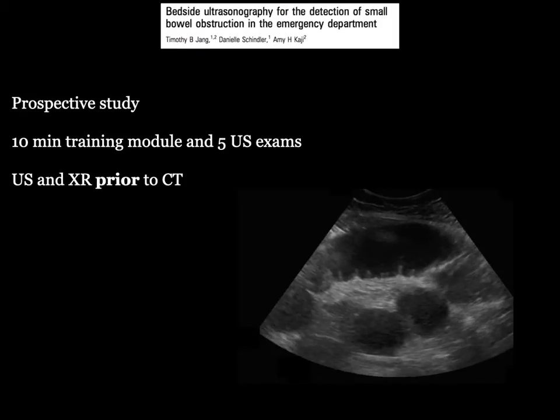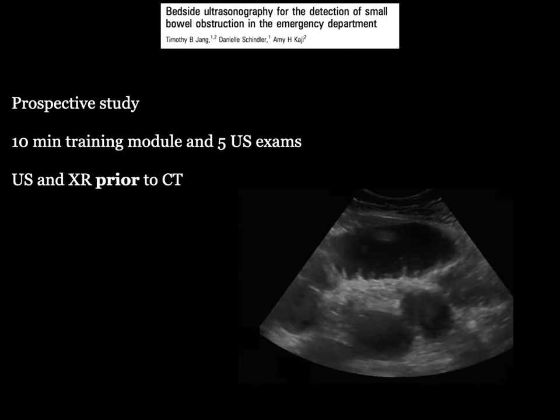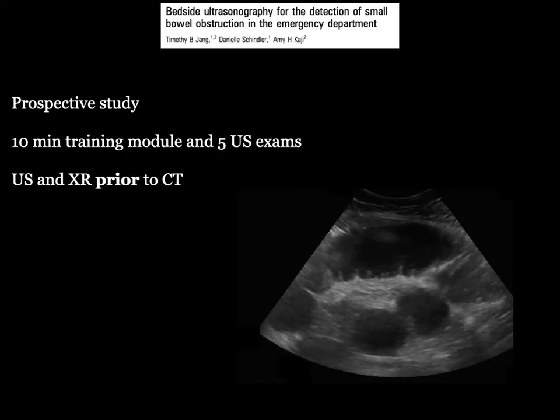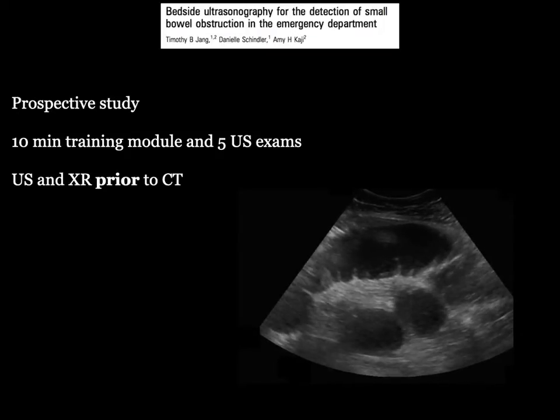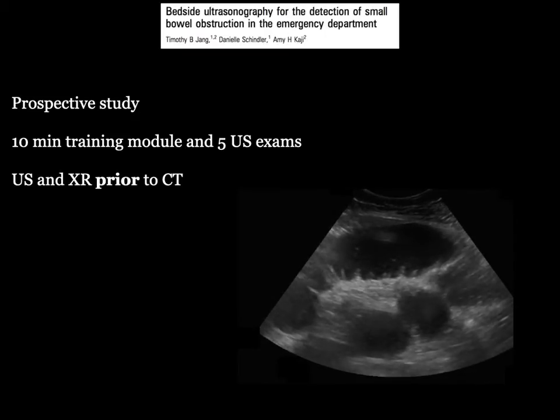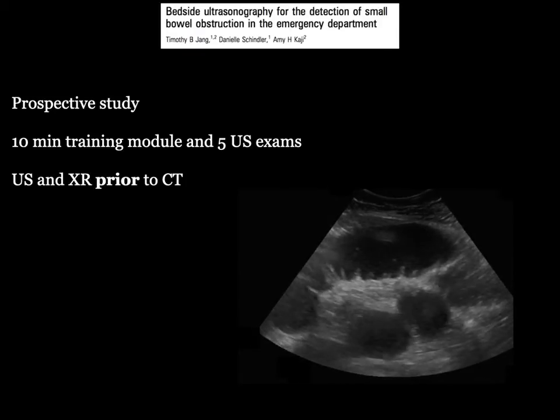Individuals who helped to enroll patients, and this included residents and attending physicians, had a 10-minute training module and had to perform 5 ultrasound exams before they were able to start enrolling patients. All patients underwent both plain film imaging and a CT scan to look for a small bowel obstruction so that the authors of the study could compare ultrasound to X-ray to CT scanning.